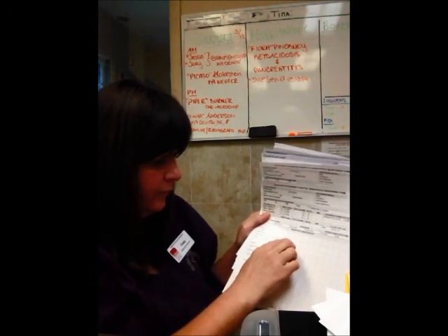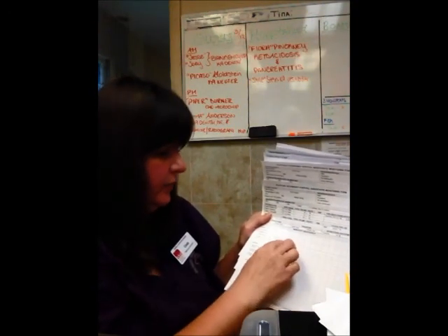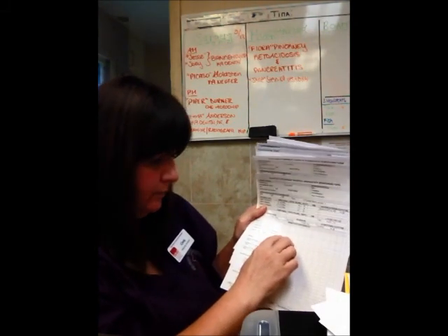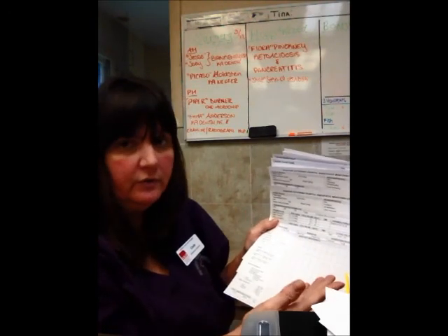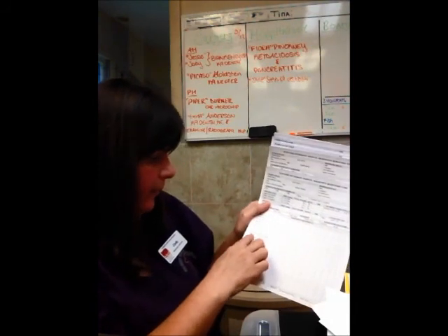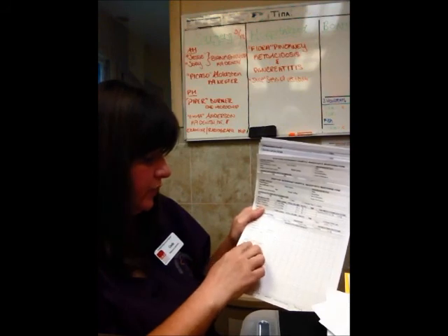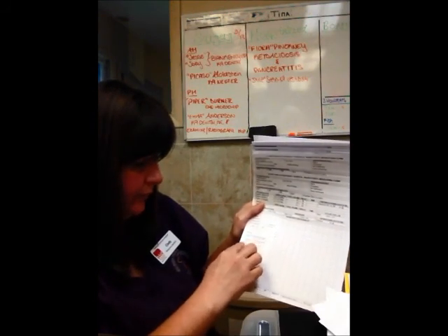We only have 1 liter per minute for our oxygen. We don't have a 2 liter system. We only have a 1 liter system. So our oxygen will always sit here or below, and then whatever sevoflurane we have them on, we'll decide based on their anesthetic what sevo we will be on. Our ER plan, so our emergency drugs, we use atropine to start with. We'll have a dose of epinephrine and lidocaine.